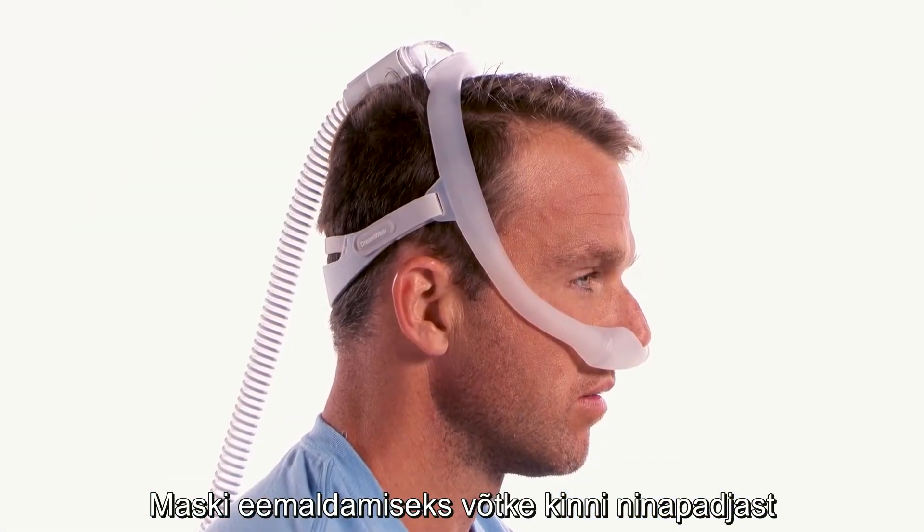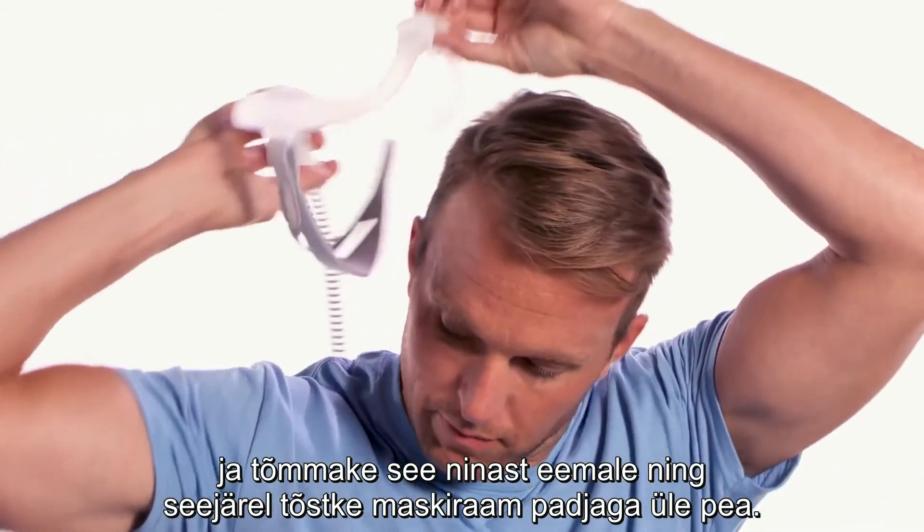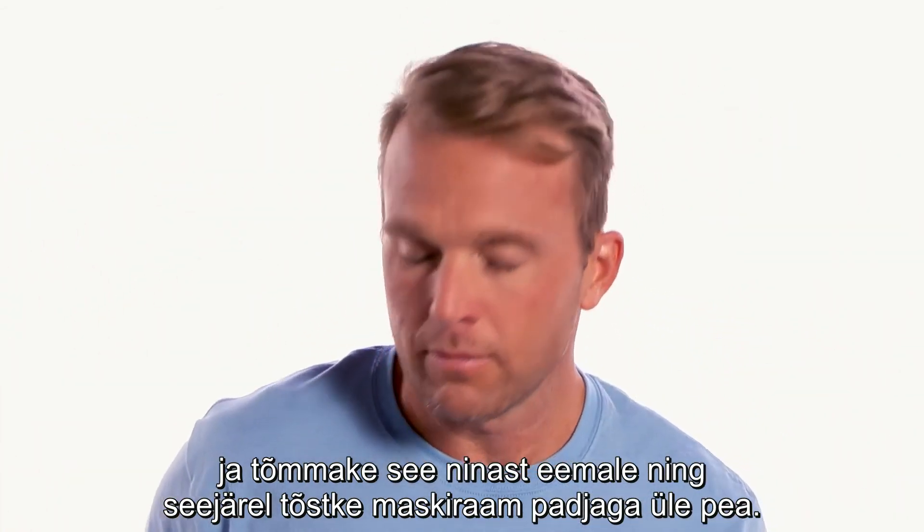To remove the mask, grasp the cushion and pull it forward away from your nose. Lift the cushion and mask up over the top of your head.